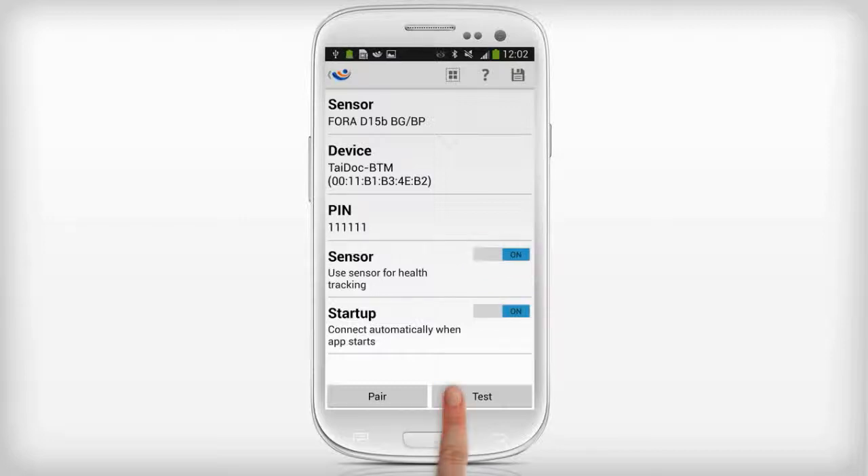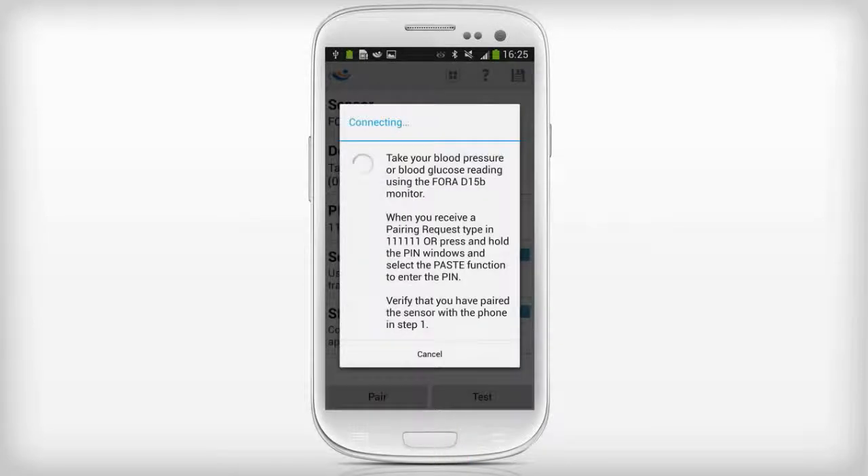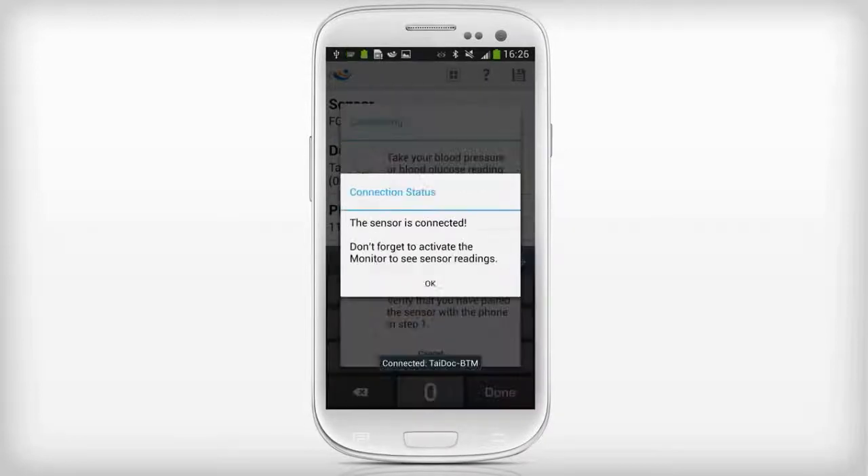Press the Test button to check if the device is correctly configured to work with MyFitness Companion. Take a blood pressure measurement with the Fora device. If successfully configured, you will see a confirmation pop-up. If unsuccessful, repeat the Bluetooth pairing process.